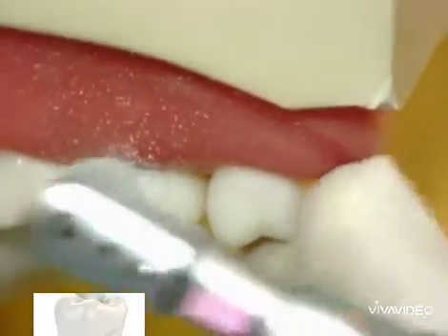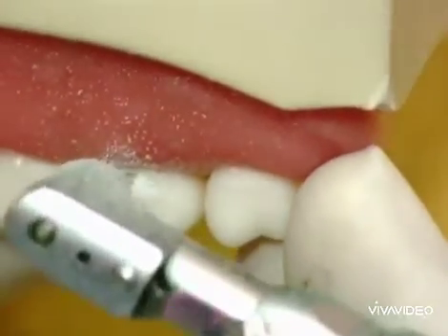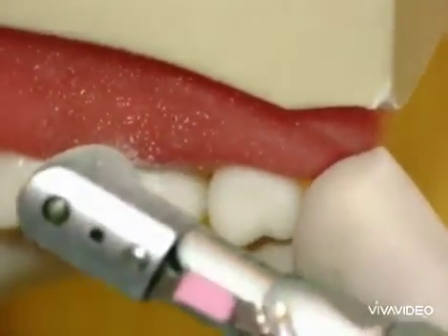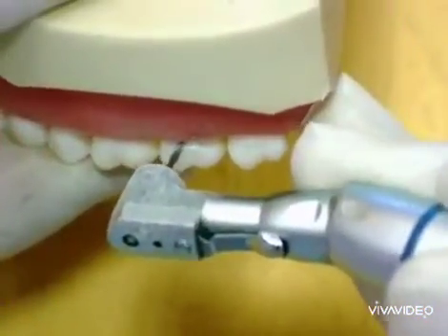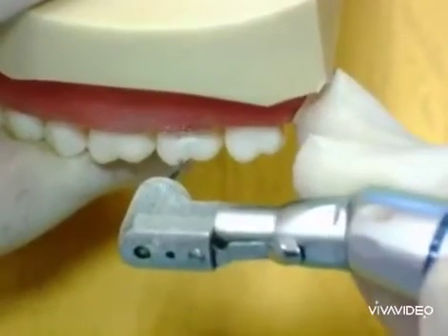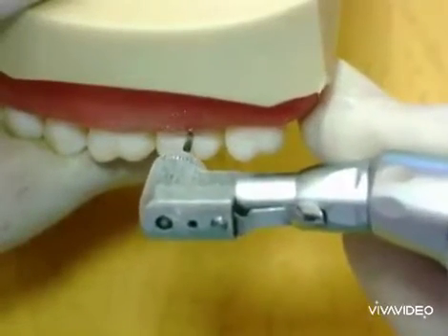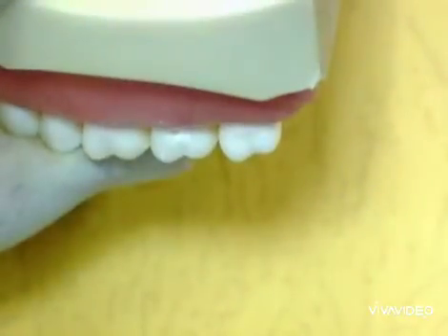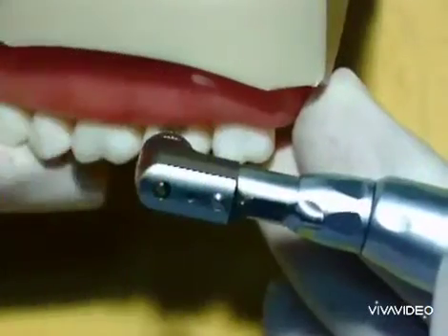Using the fissure bur to do the outline form: the occlusal or incisal outline should be straight and parallel to the occlusal plane, while the gingival outline should be straight and parallel to the occlusal outline. The mesial and distal outlines should be straight and parallel to the mesial and distal tooth outline in the gingival one-third.